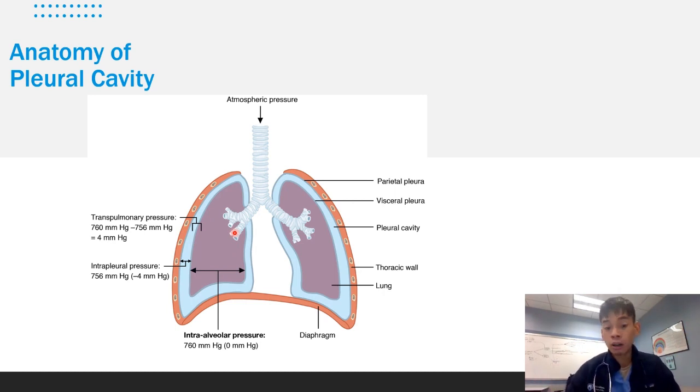Pleural effusions are possible as you have fluid buildup, similar to our last module, but for the eFAST examination, we're not necessarily looking for pleural effusions this time, but more so we're looking for whether air has escaped within this sac. So instead of fluid, we're looking for air, okay? And that air does not look as clean as it does on ultrasound, but we'll get to that in a second.